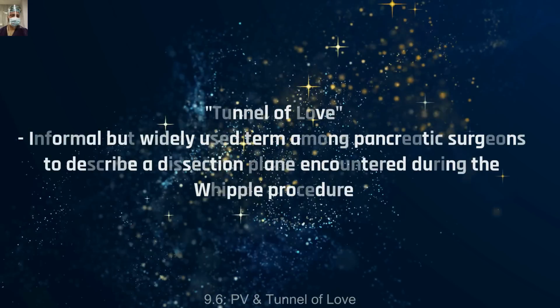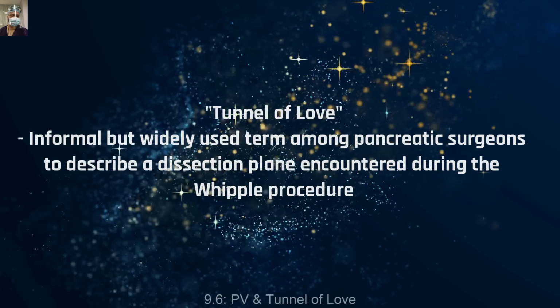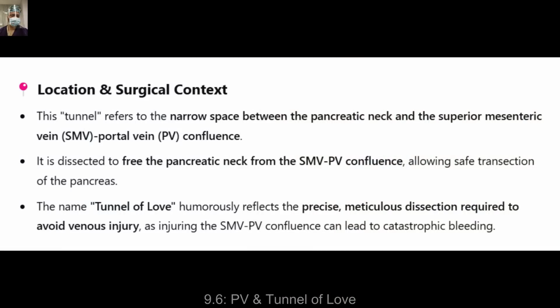So, what is the tunnel of love? It is an informal but widely used term among pancreatic surgeons. I hope many of you have already heard about it, to describe a dissection plane encountered during the Whipple procedure. So, what is the location and surgical context? This tunnel refers to the narrow space between the pancreatic neck and the superior mesenteric vein, portal vein confluence. This is called the tunnel of love.